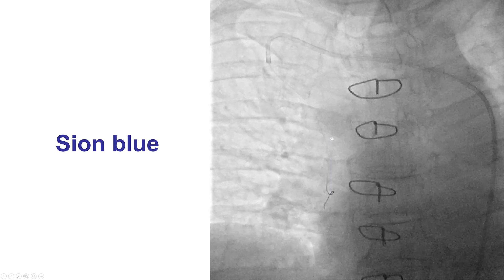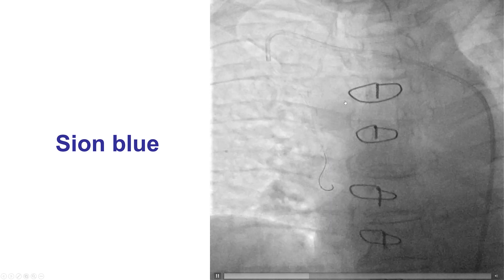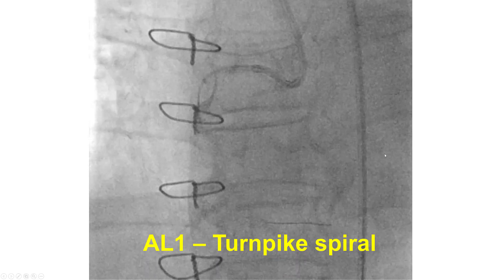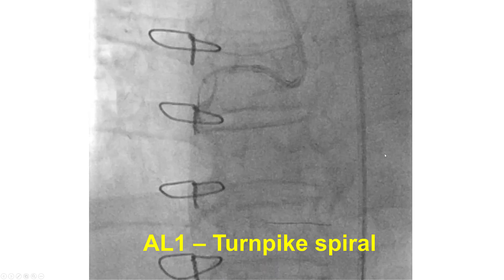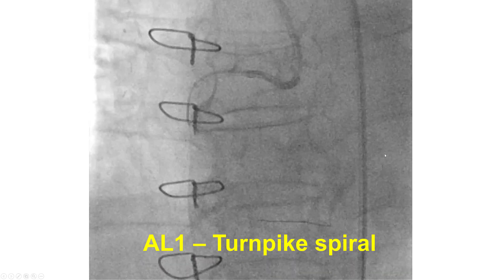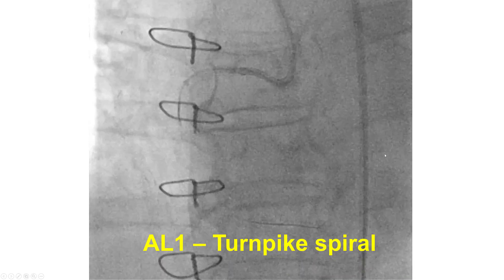We then used a Sion Blue workhorse guidewire, but had significant difficulty advancing it through that lesion. In the process, the patient developed significant inferior ST-segment elevation — a highly concerning warning sign. We stopped and the STs returned to baseline. We decided not to persist in treating the RIMA anastomosis and instead switched to the native right coronary artery.